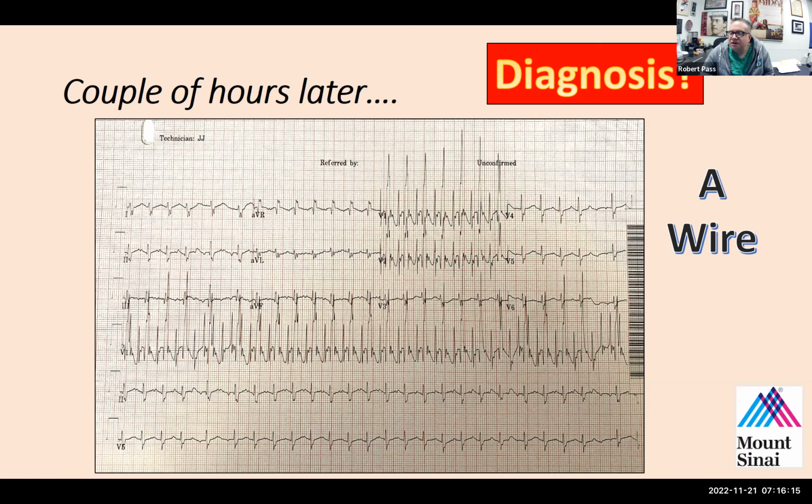Why do you think the patient went into atrial flutter? We were being paced. I forgot to post the heart rate trend, and we were very solidly at 145 for a number of hours, and then it suddenly went up to this ventricular rate. Why do you think that could have happened?